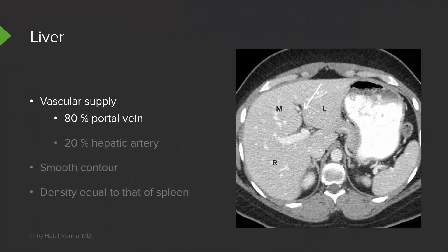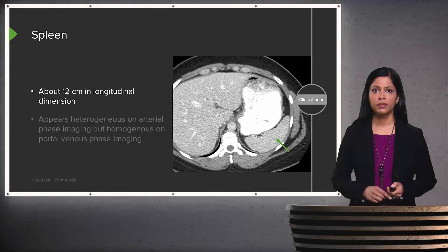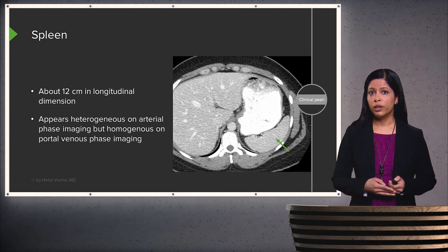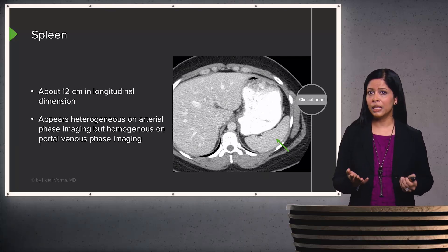About 80% of the vascular supply to the liver is portal vein, with about 20% from the hepatic artery. Normally the liver should have a very smooth contour — if it doesn't, suspect an abnormality. The density of the liver should equal that of the spleen. The spleen is about 12 centimeters in longitudinal dimension, best measured on ultrasound. It tends to appear heterogeneous on arterial phase imaging but should appear homogeneous on portal venous phase imaging, at about the same density as the liver.